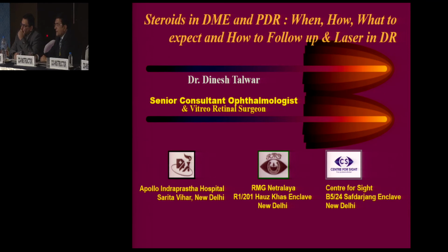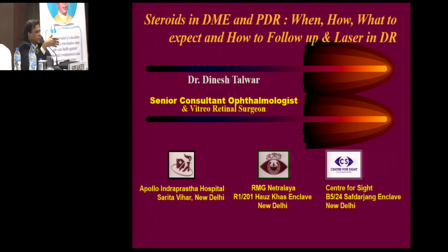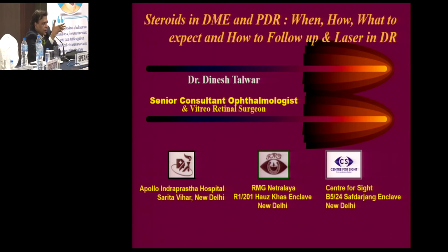Actually, in phakic eyes, the advantage is if you put in air first, then you can go right till the periphery. Under air, vitrectomy works very well, because the anterior face of the bubble keeps the lens up. The minute you try to touch the lens, you'll see a kind of a fold coming up, so you quickly move the cutter away. So you can go right till the periphery under air. So I do a lot of under-air vitrectomy.